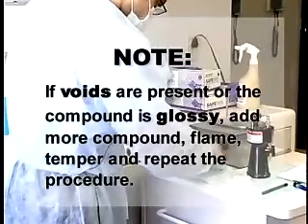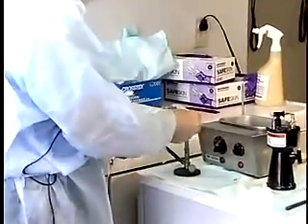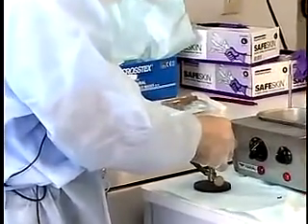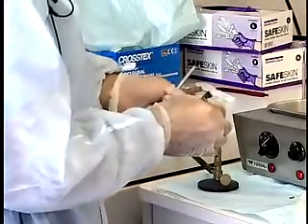If voids are present or the compound is glossy, add more compound, flame, temper, and repeat the procedure. Add compound to the right side of the tray from the previously molded area to the pterygomaxillary notch.